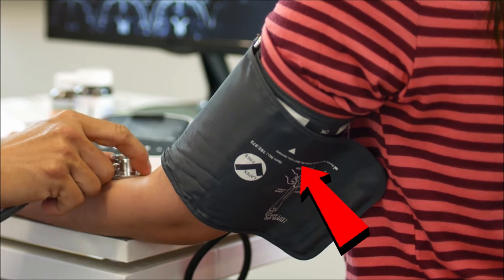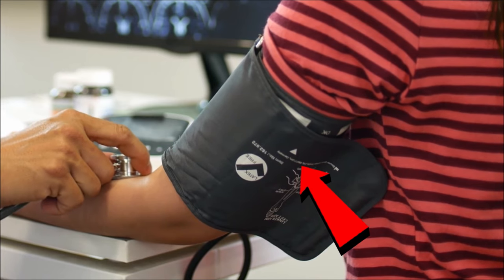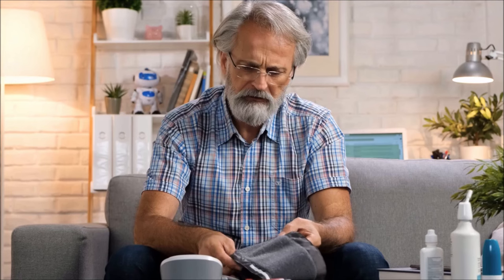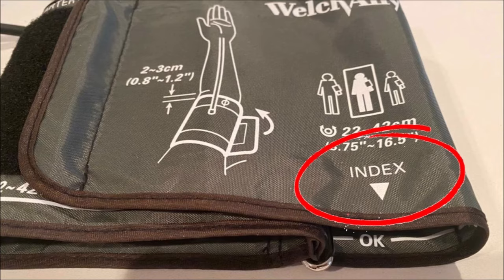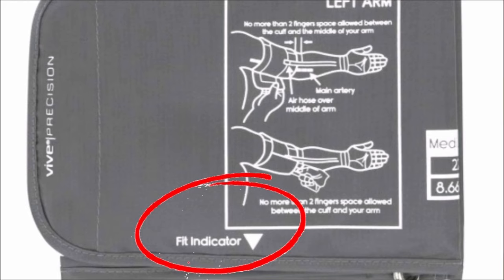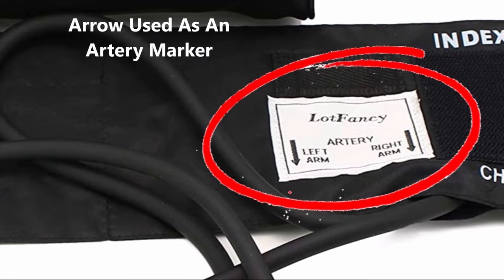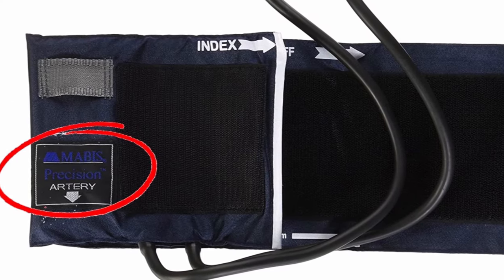Which way the blood pressure cuff arrow points depends on which company's cuff you have. Unfortunately, there is no industry standard way to mark the cuff, and each company may have a different purpose for the arrow. I'm going to cover all the different scenarios, and the first one is when the arrow is used as the artery marker.